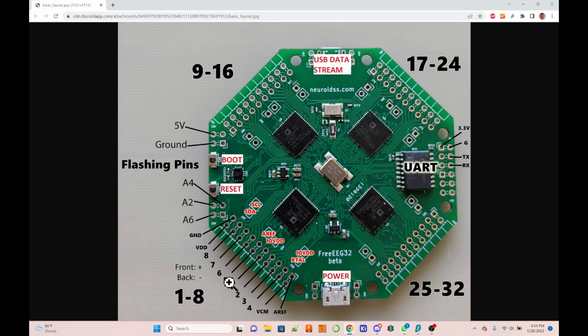Then the next comparison with OpenBCI and how to connect. On OpenBCI, the SRB2 pin goes to one of the earlobes. And then that's it. And then you just have all of the positive terminals for every channel go to one position on the head where you want to measure. It's different here. We don't have a comparison to the SRB2 pin. Instead, every individual channel has both a positive and a negative terminal. So it's a full bipolar setup.